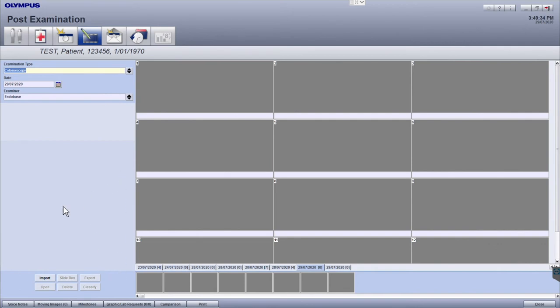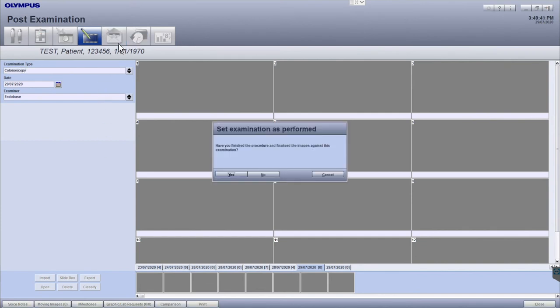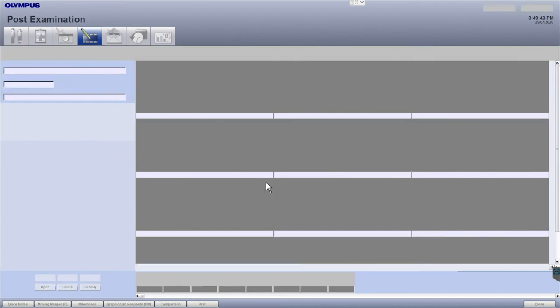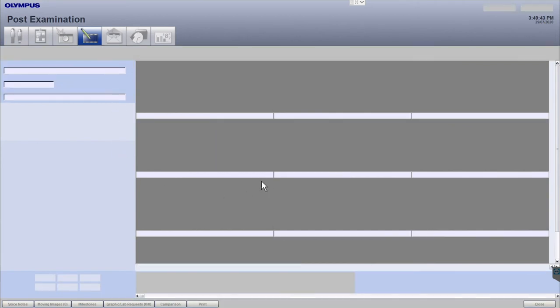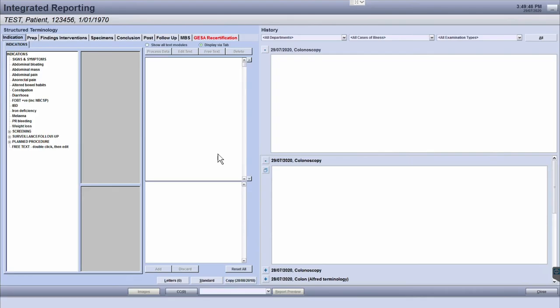Finally, to complete the documentation workflow, the icon with the open envelope is the integrated reporting module. Here, you will be able to use the dictionary of terms or the structured terminology, as we call it, to quickly populate your report in a grammatically correct, standardized and auditable form.